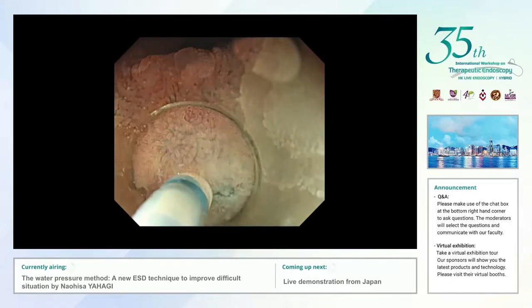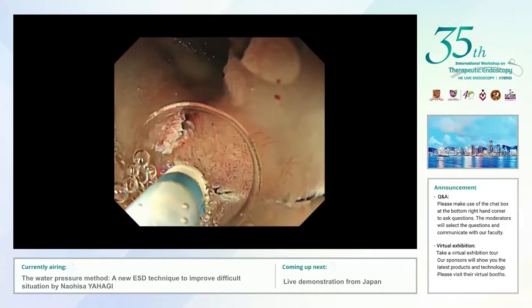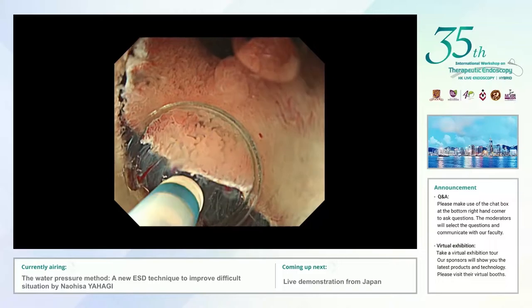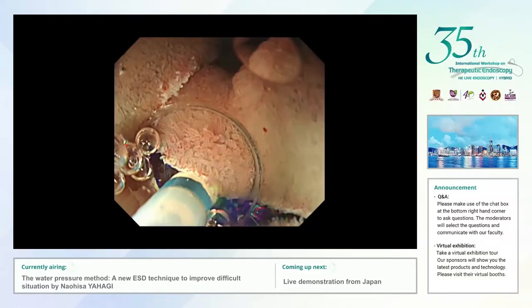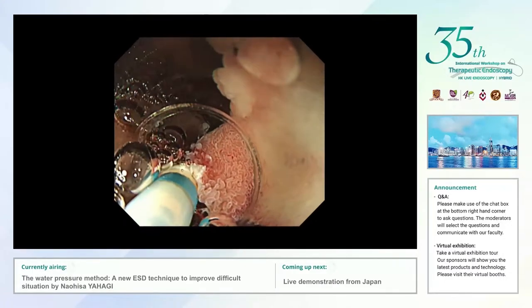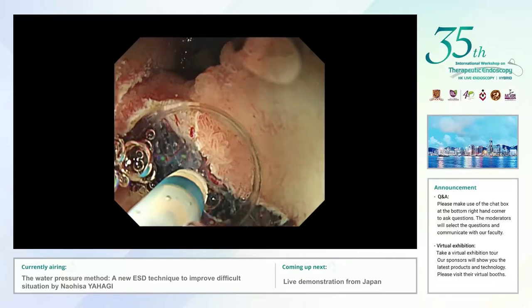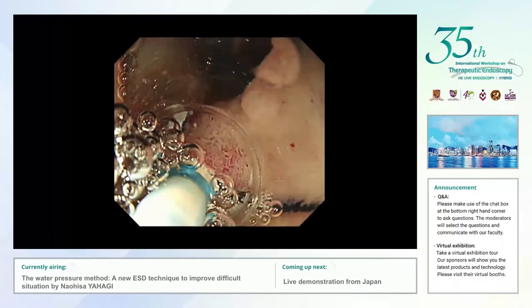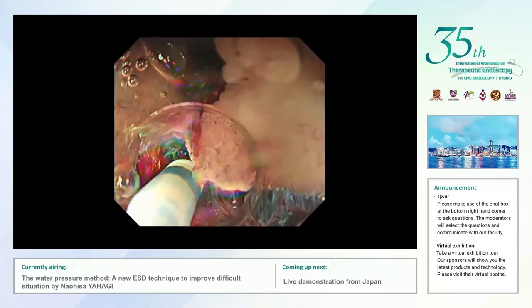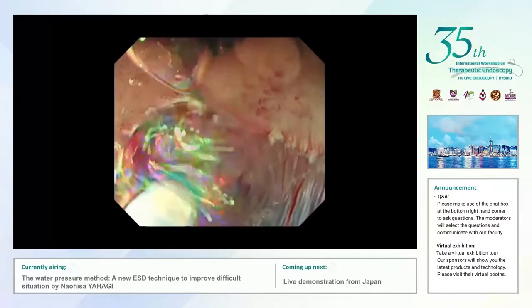Now we can see the nice incision line using water pressure. I then quickly moved back to the oral side, again injected the submucosal fluid cushion through the knife, and continued the mucosal incision going to the left side, connecting the incision line. After making the initial mucosal incision, I used the water pressure to open the submucosal space and quickly started submucosal dissection. The water pressure method is quite effective to open the submucosal layer, allowing me to easily open the submucosal space using the active pressure of flushed water.